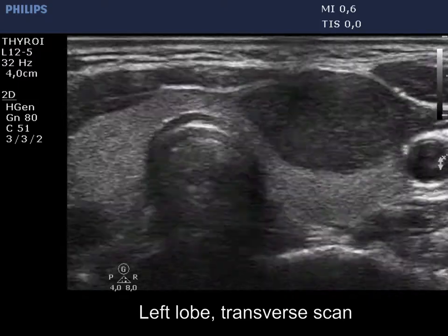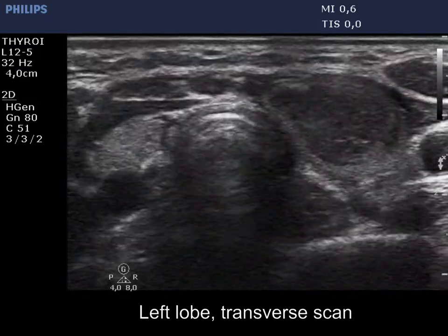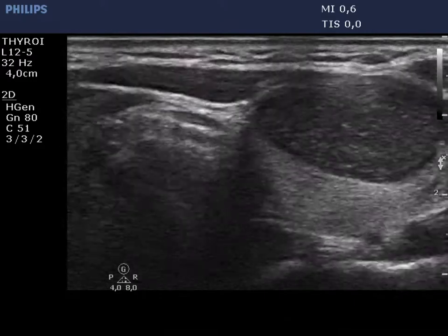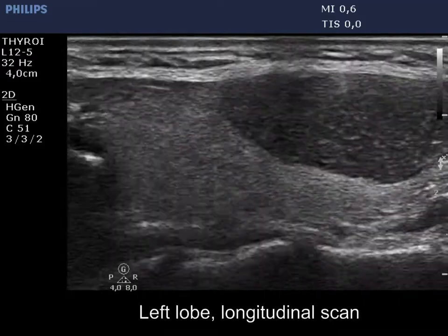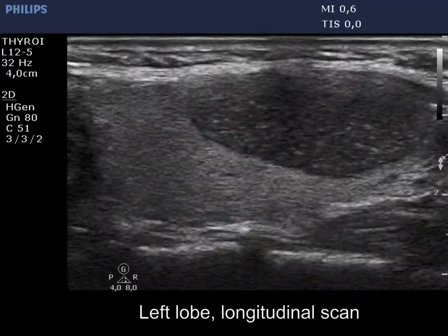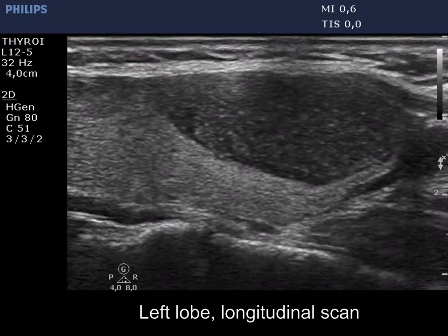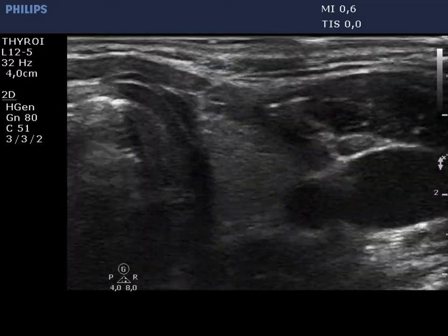The left lobe is also echonormal. There is a large hypoechoic mass in the ventral part of the lower two-thirds of the left lobe. The lesion has sharp borders.